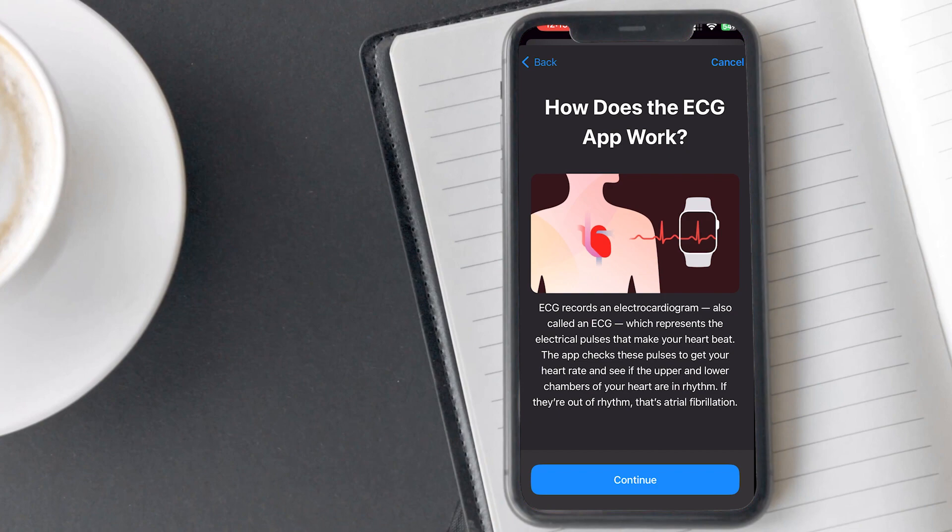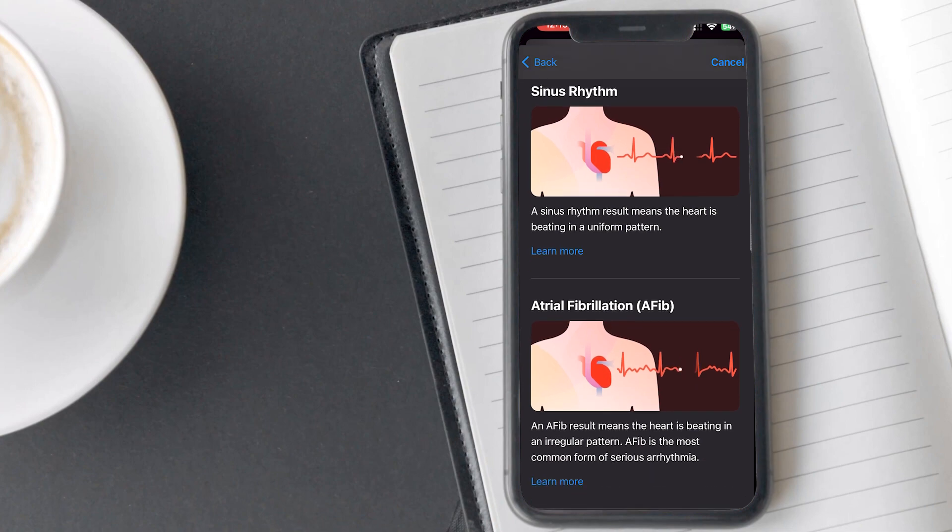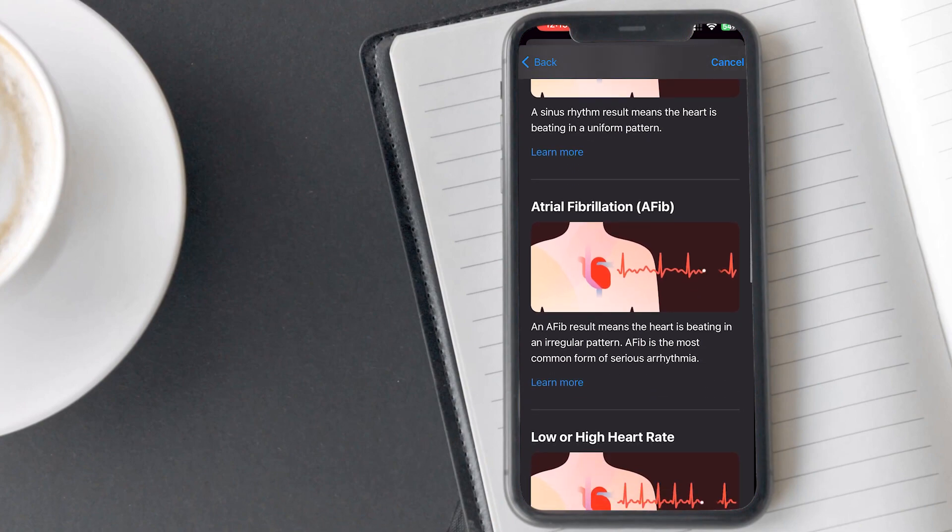Tap on continue. Here you will see the results that you may get after taking your ECG. If you see sinus rhythm, it means your heart is beating in a uniform pattern. If you see atrial fibrillation, it means your heart is beating in an irregular pattern, which is the most common form of arrhythmia.